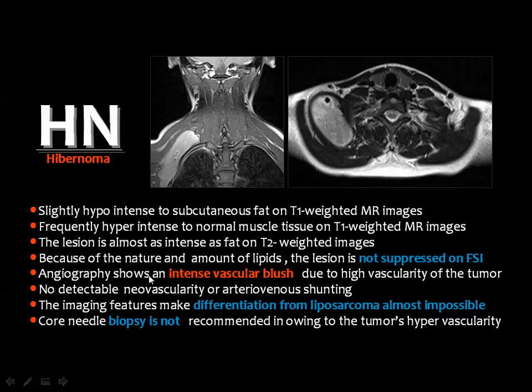Then angiography will show intense vascular blush of the lesion, and there is no neovascularity, there is no hypervascularity of neoplastic tissue, for example, or arteriovenous shunting.